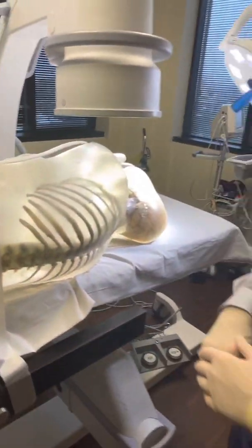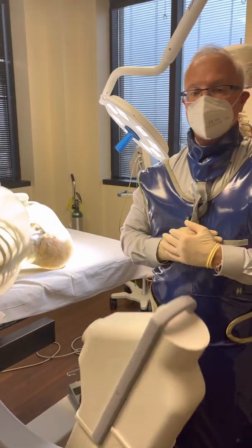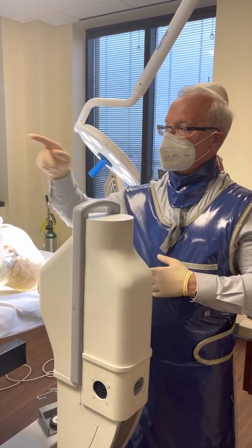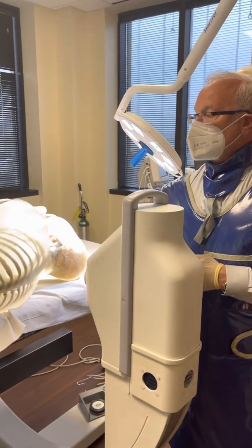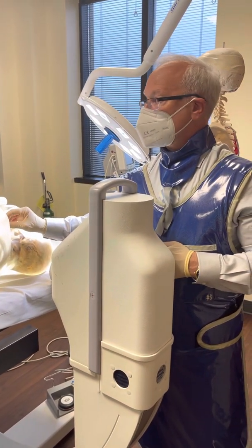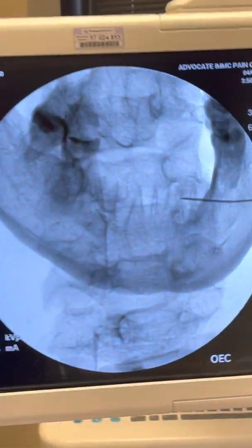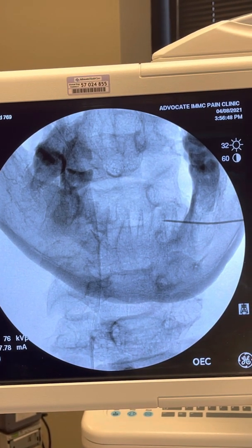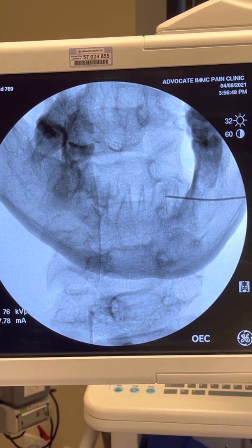Now before I perform sensory and motor stimulation, I'm going to be sure that I'm in the middle third of the facet joint using this AP view and orientation. That's the appropriate anatomical location — you can see that I'm in the cephalad and lateral part of the canal, in the central portion of the facet joint, about the middle third of the facet joint for this C4 dorsal root ganglion injection.